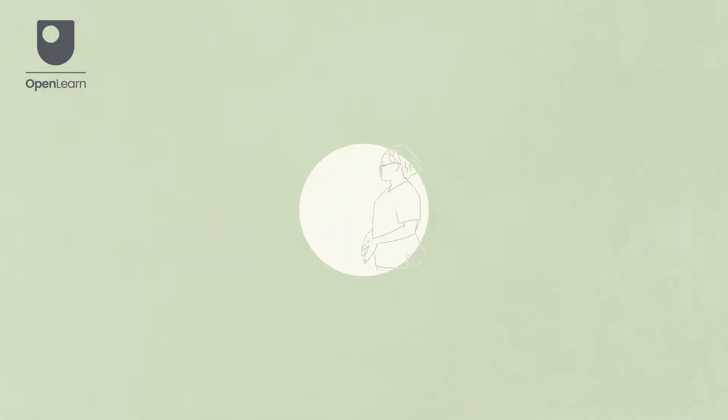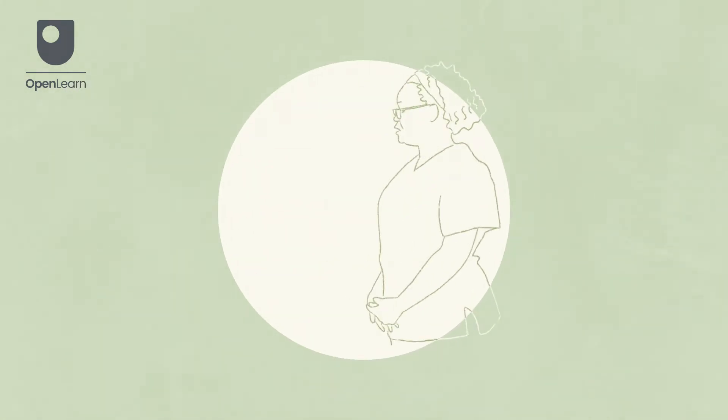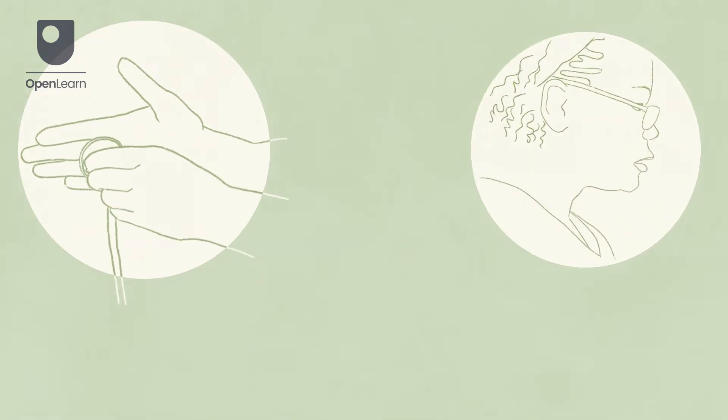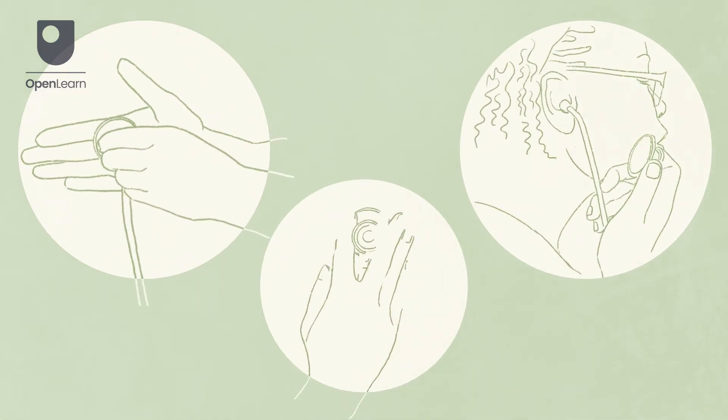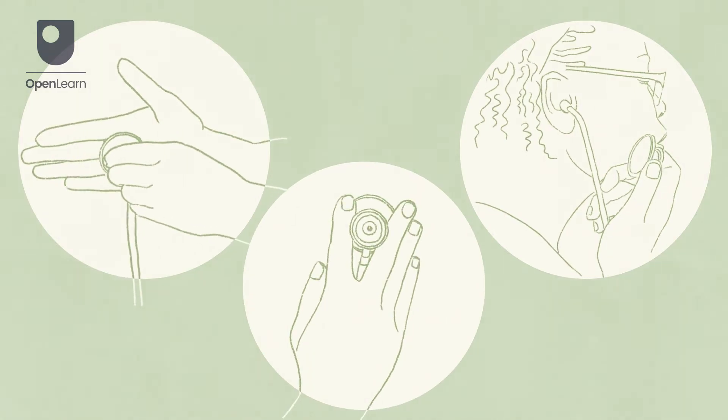Inform the patient that you are commencing the procedure before placing it on the patient's skin. If necessary, warm the stethoscope between your hands before starting. Position the earpieces comfortably in your ears and hold the chest piece between the index finger and middle finger of your dominant hand.